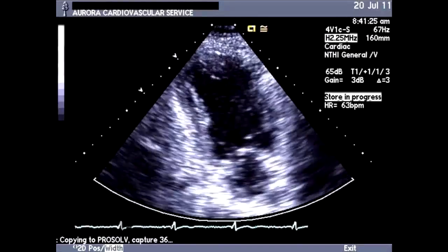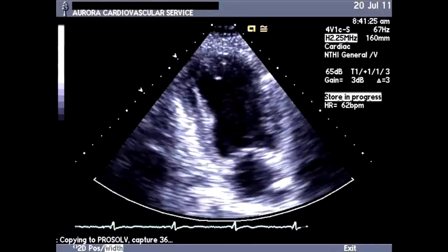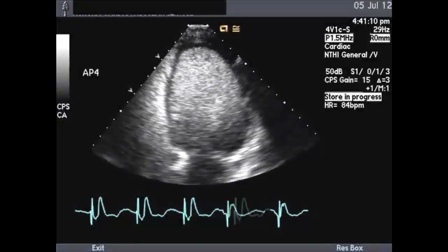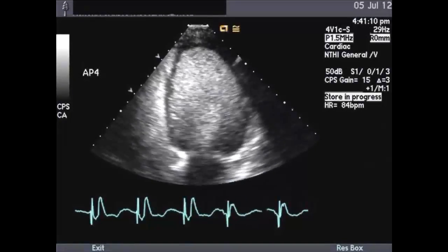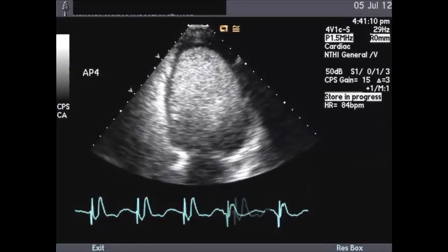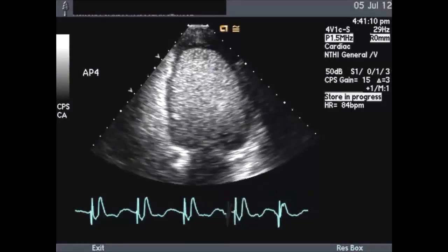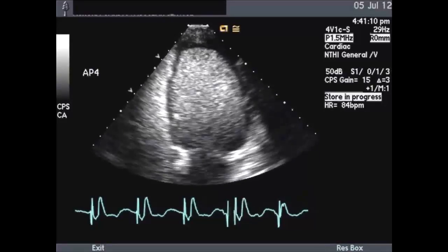Well, in all 3 cases, the sonographers here decided to use contrast. So here is case number 1. Remember what you thought. Case number 1. I like to show this to demonstrate that even sometimes when you're pretty sure there is a thrombus, there isn't, and as in case number 1. Looking at those pictures, I was pretty sure that we would find something there.